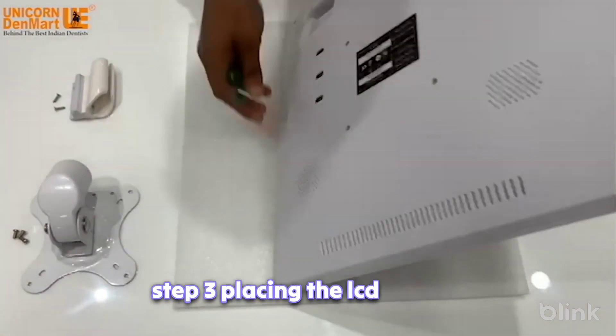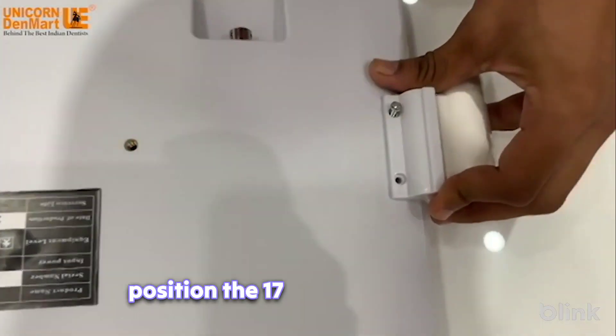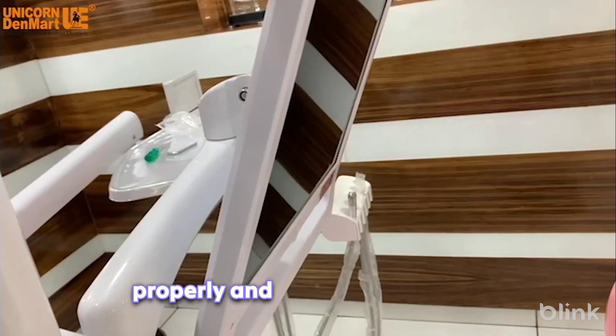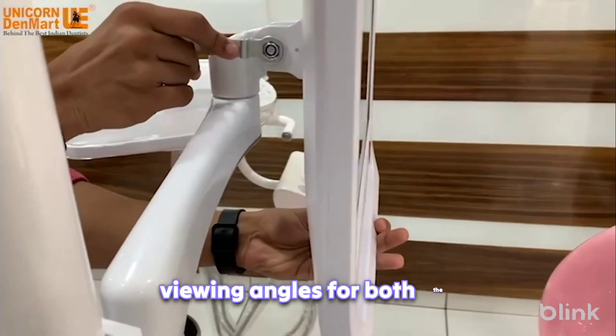Step 3: Placing the LCD display. Position the 17-inch LCD display on the display holder. Make sure the display is aligned properly and offers comfortable viewing angles for both the dentist and the patient.